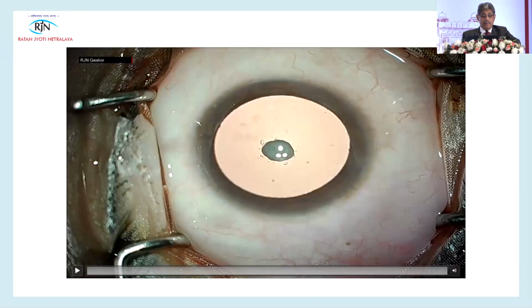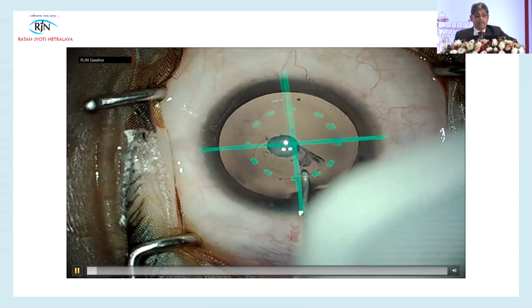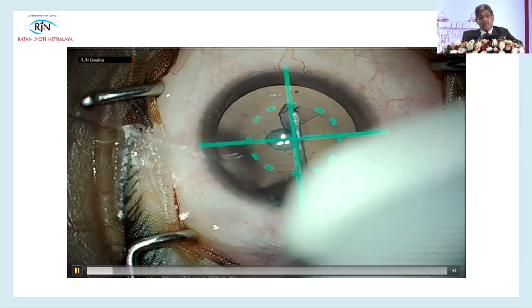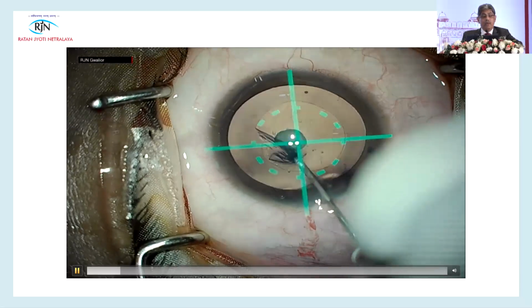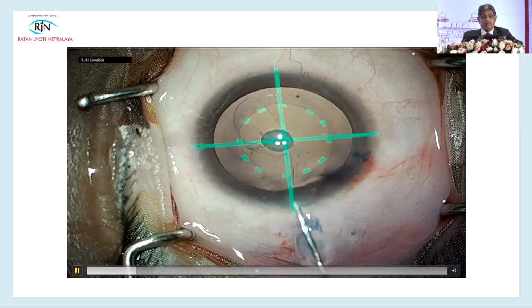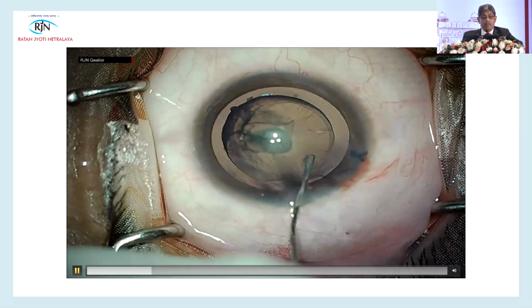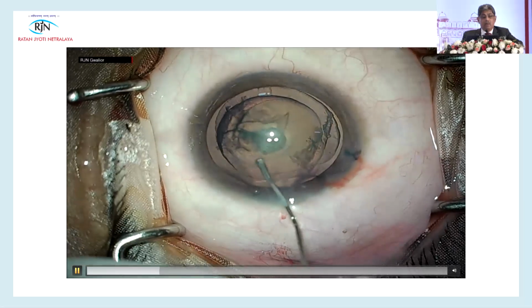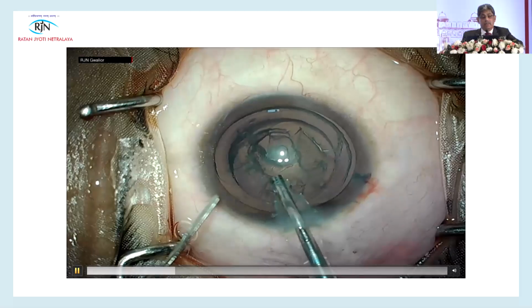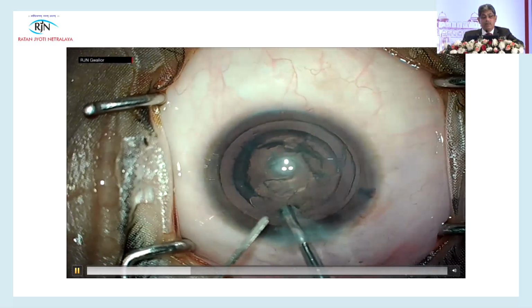So this is the case, a young patient having a posterior polar cataract. All these patients have very poor quality of vision, so they always come forward for early cataract surgery. Hydrodelineation is done, and a band of epinucleus is left over, and then this is a soft cataract.